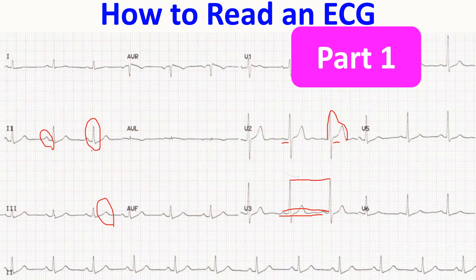Otherwise, a depolarization wave should have a polarity opposite to that of a repolarization wave. Now, where is atrial repolarization? Atrial repolarization is not visible in the usual surface ECG, but it corresponds to the PR segment and part of the ST segment. The upsloping ST depression seen here is supposed to be due to atrial repolarization, also called the TA wave.